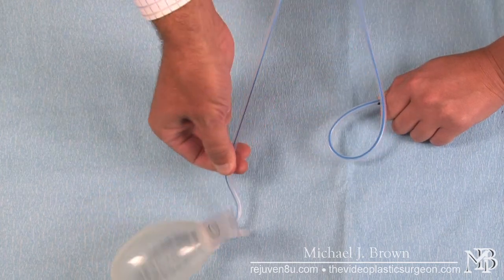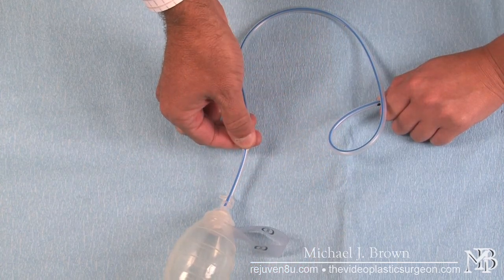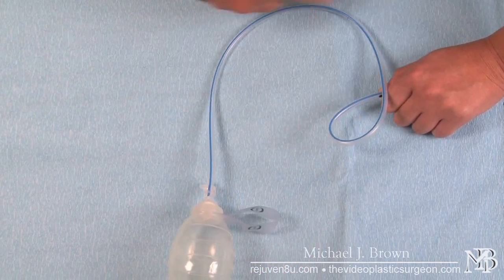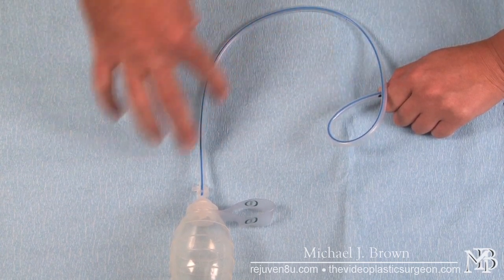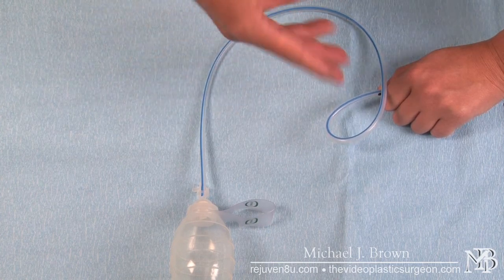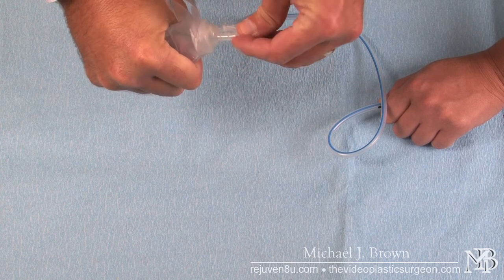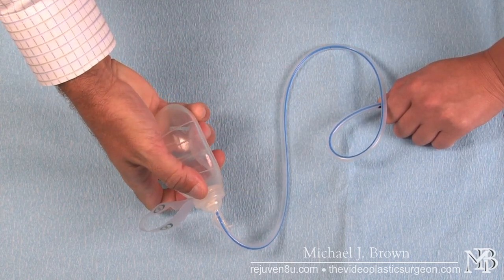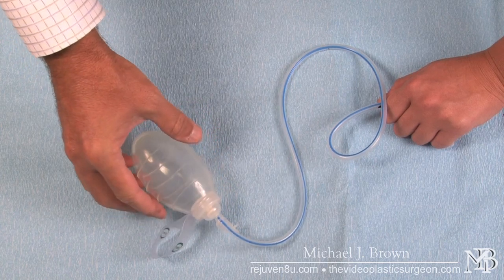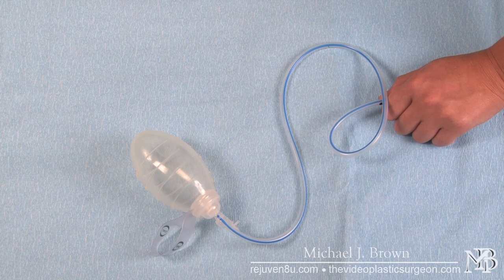As you do this, the bulb will actually fill up with the clot, and when you let go, the tubing itself will be clear. In essence, you have stripped the drain to make sure it's patent or open. This way it will function to maximum capacity, allowing us to safely manage the outputs from the wound. Proper drain care will increase your speed of recovery and improve your aesthetic result.